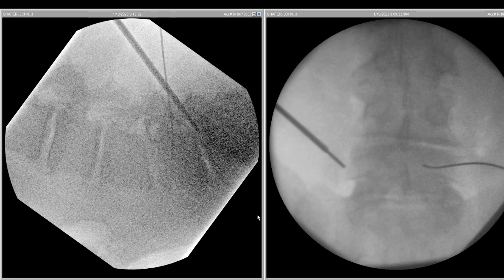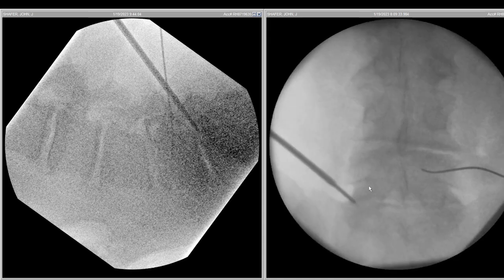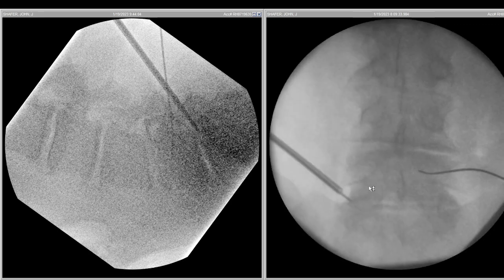Here we have the probe, which is stimulating — the tip of it is stimulating the tissue at three milliamp. It can be in triangle, and then we enter.